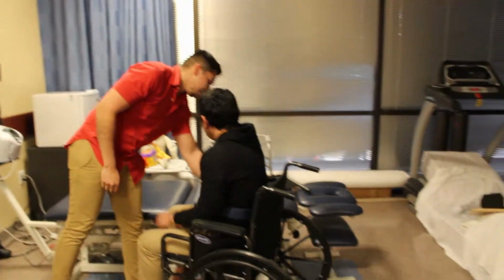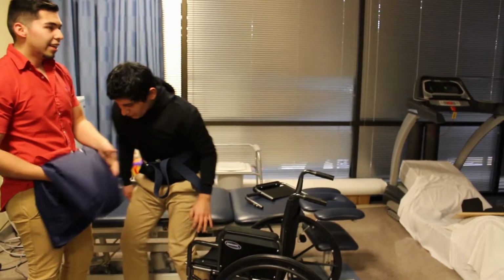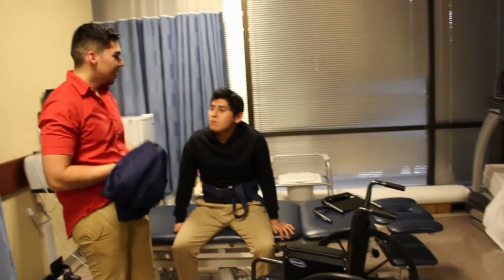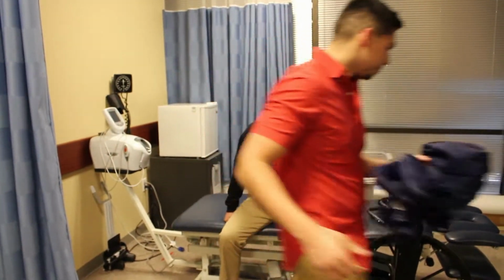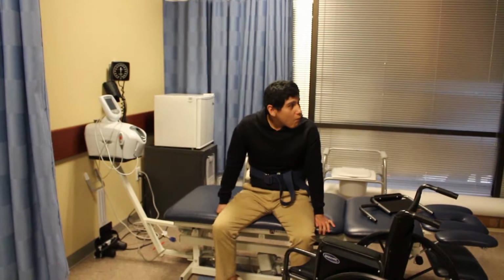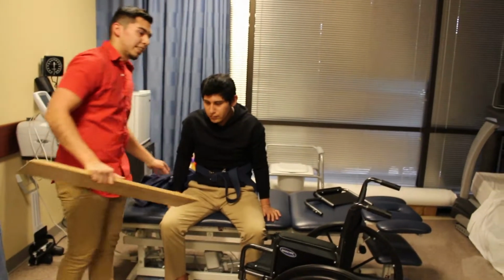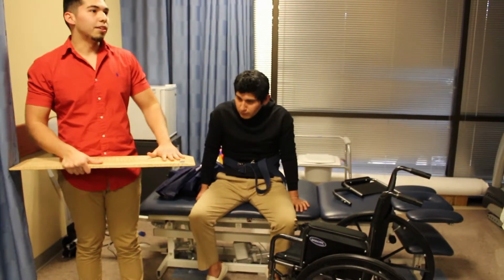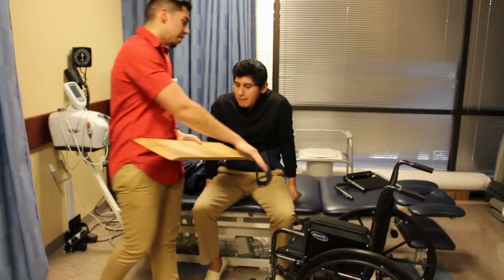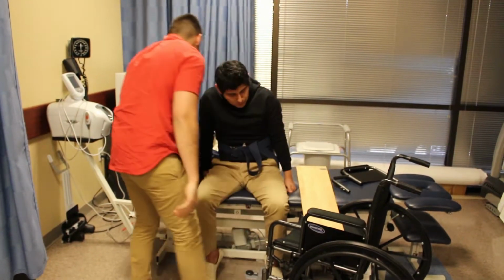The second thing you could do, let's come back this way. Let's say the patient has a sliding board available in his room, but the patient doesn't have enough strength to push himself through the sliding board onto the wheelchair. So what you want to do is basically the same thing.